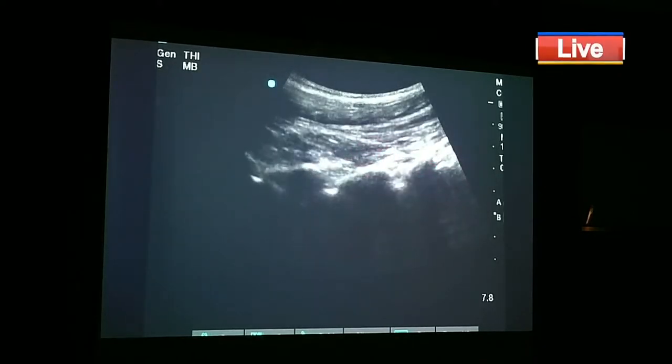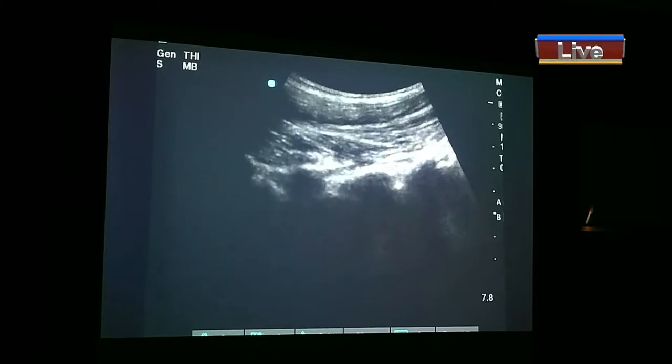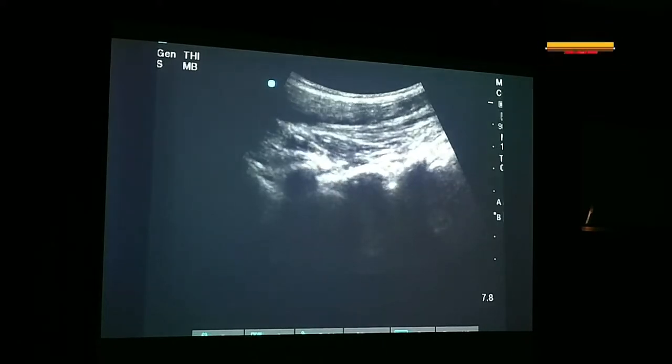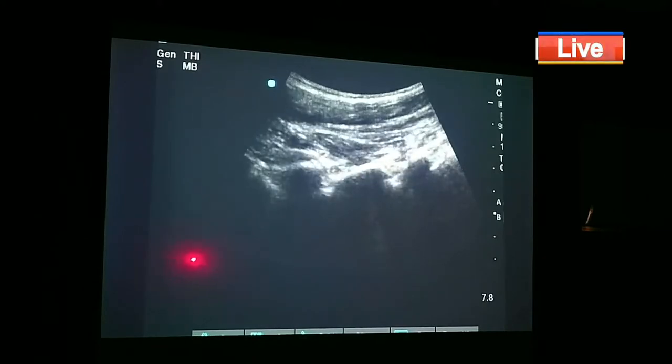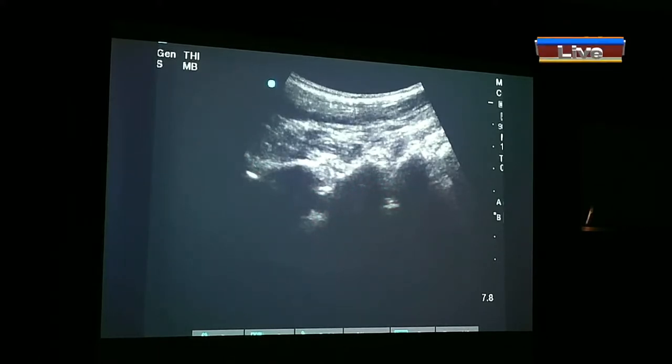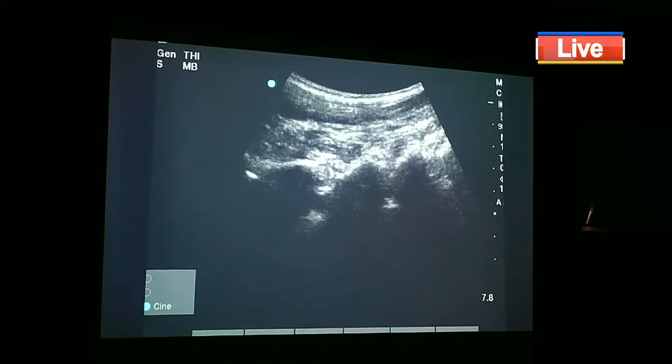And now I am going to just tilt my probe. Till now I am perpendicular like this. Now I am going to slightly tilt, and I am going to come from here, and this will improve my view. Can you see this view improve? And in this I can see clearly two complexes. Yes, freeze. So if you go laterally, you will always be able to see much more and with much more certainty. Okay. Now let's measure the space here.